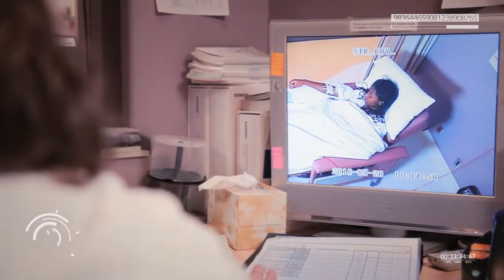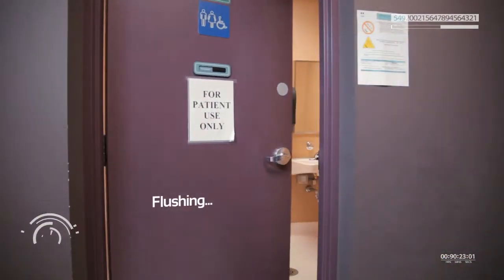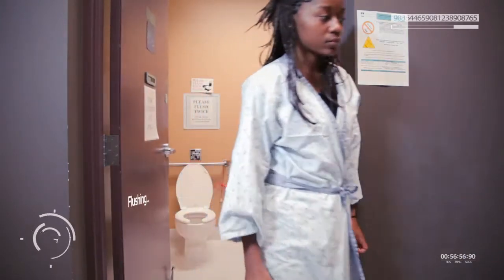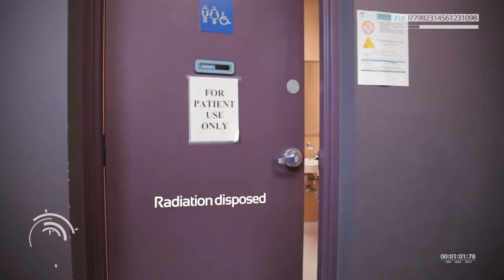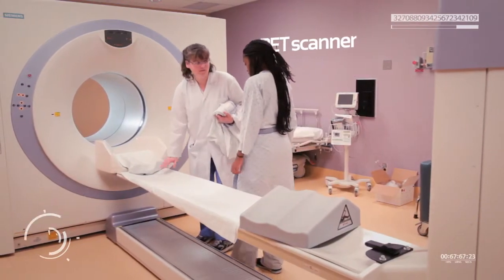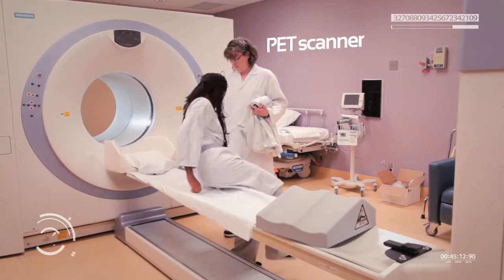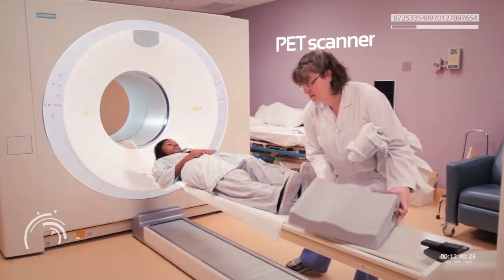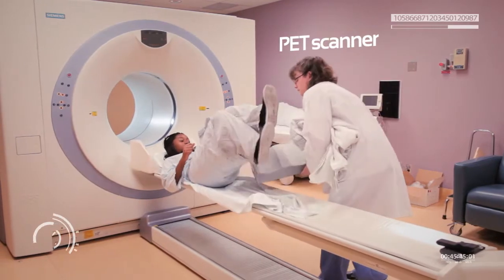They sometimes give patients a diuretic so they pee out some of the radiation. A full bladder can obscure things in the scan. The technologist helped me get in place for the scan and led me onto a bed that will move into the machine, making sure that all parts of my body would be visible to the camera.